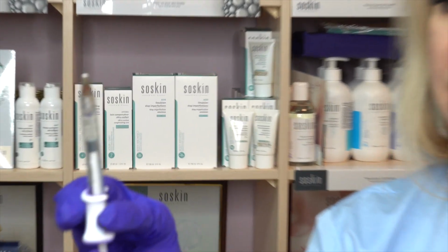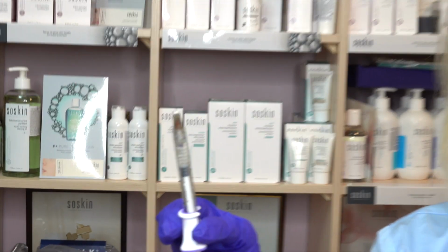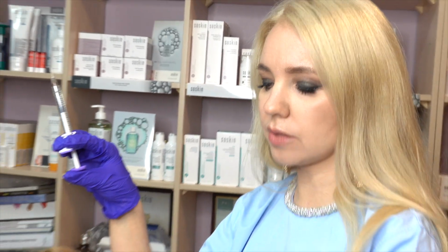Look guys, right now you can see a positive aspiration test, and you always ask me, does it make sense to make aspiration? Look, I was on the bone, I did my aspiration test, and I was waiting less than 1 minute, and you saw the blood in the syringe. It means that it's a positive aspiration, and we have to change the point of injection. And I want to show you another point here.